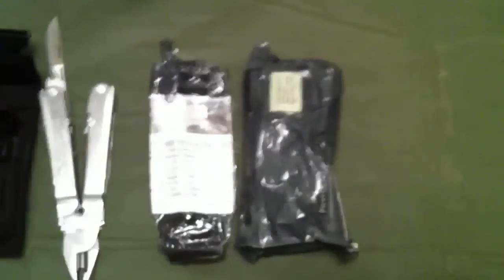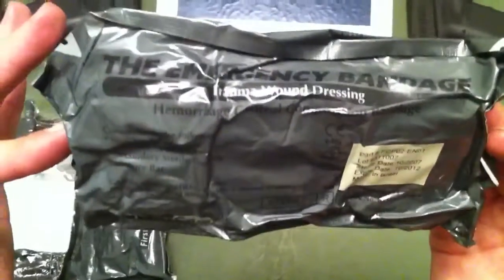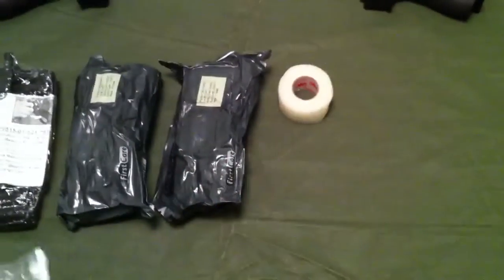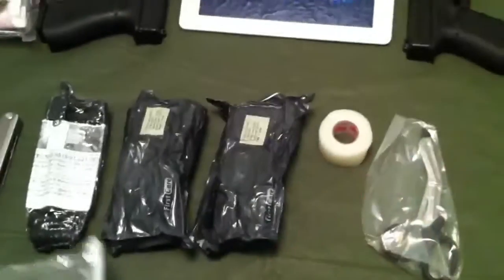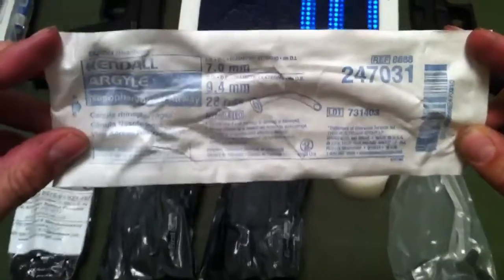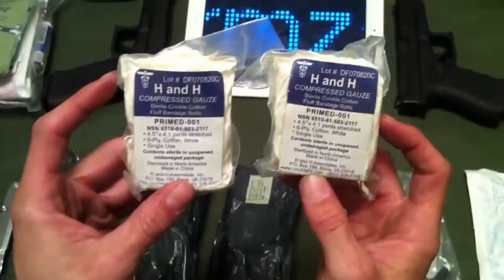Especially for our boys over there — men over there fighting for our freedom. We have another trauma wound dressing. Got some medical tape. Trauma shears. And now we have an airway and two compression gauze.